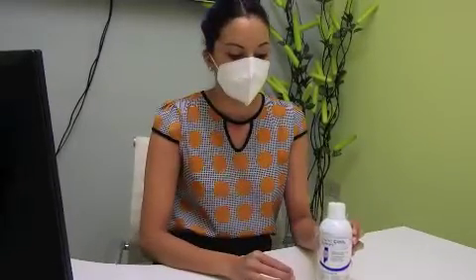So basically it is a cold test, right? It's a spray that comes like this, and it's applied to the tooth for a few seconds, and the patient indicates whether they get any sensation on the tooth. If the sensation lasts for 10 seconds or so, then we estimate that it's a normal tooth. If it prolongs for a longer time, then it's an indication to us that the tooth needs some sort of treatment in terms of a filling or maybe a root canal.